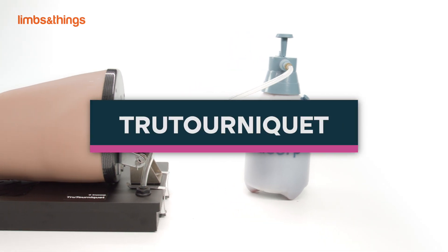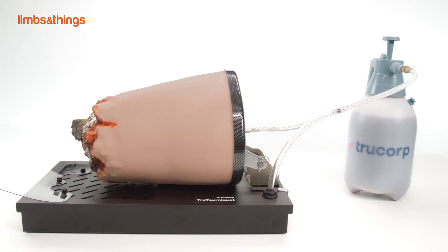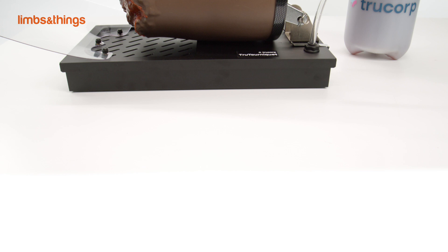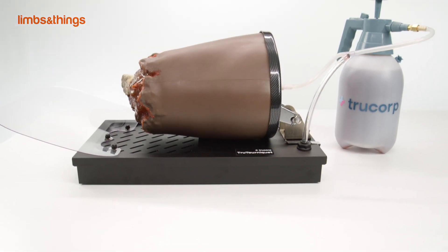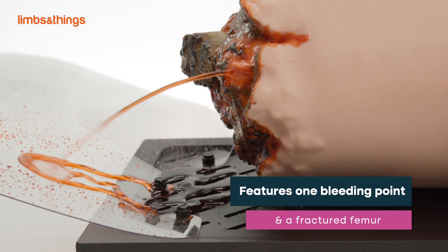True Tourniquet. The True Tourniquet has been designed to practice massive hemorrhage control in lower extremity trauma. The model represents the weight, size, and movement of a right leg involved in a traumatic amputation, featuring one bleeding point and a fractured femur.